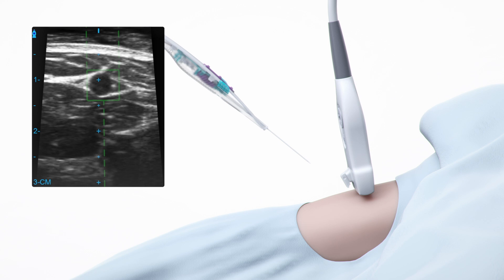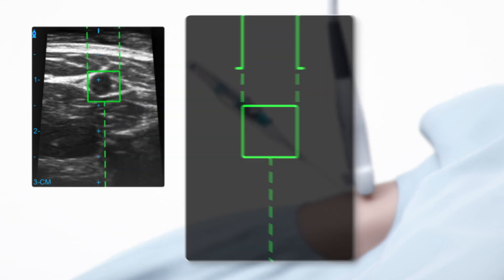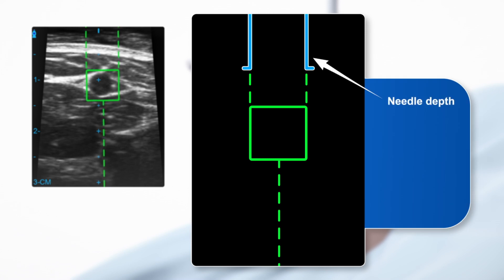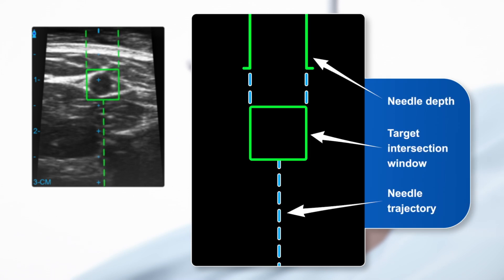Once tracking is up and running, approach at a typical insertion angle, about 45 degrees. You should seek guides for your needle depth, the target intersection window, and the needle trajectory.